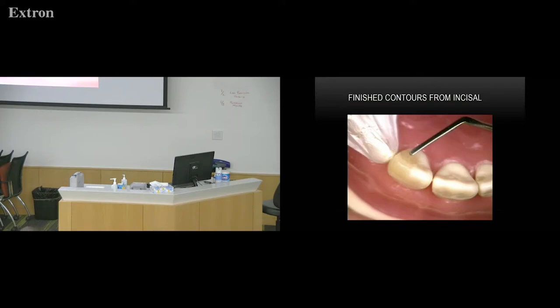No, this is all packable. The only place I personally use flowable is on the gingival margin of a class two, and very sparingly, because it shrinks more and it polymerizes, and it also is not highly filled, so that if it's in the area on the surface, it cups and wears. So this is all done with packable. Okay.